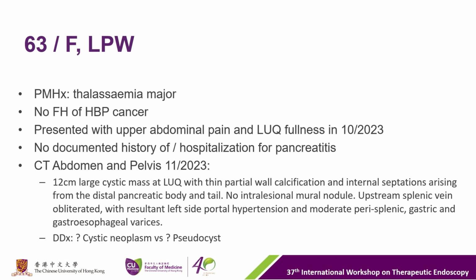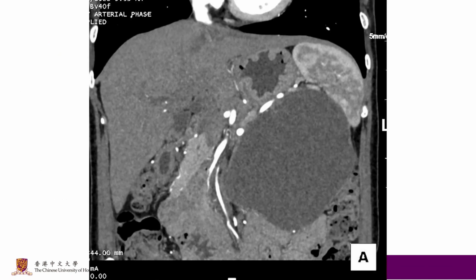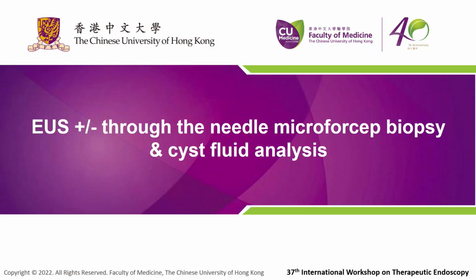Differential diagnosis including cystic neoplasm versus pseudocyst. This is the CT finding. So today we are going to perform EUS plus or minus through-the-needle microforceps biopsy and cystic fluid analysis by Professor Tang.